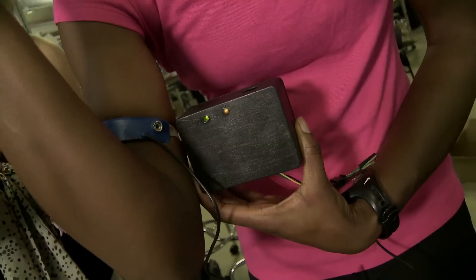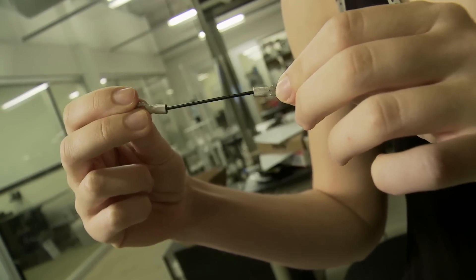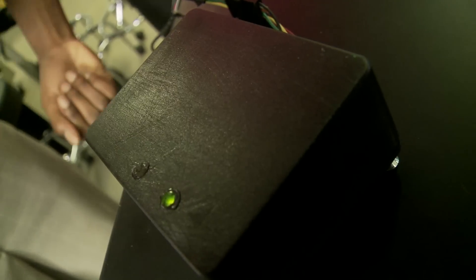What's happening in this strap is that there's a stretch sensor being stretched, and each stretch corresponds to one breath — so this light blinks as her arm is essentially breathing.